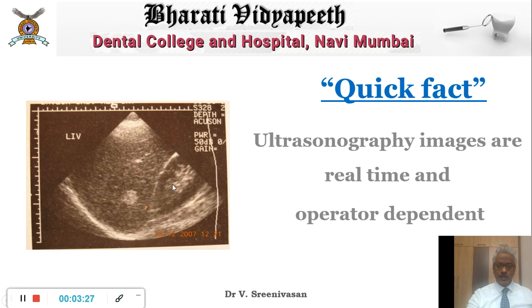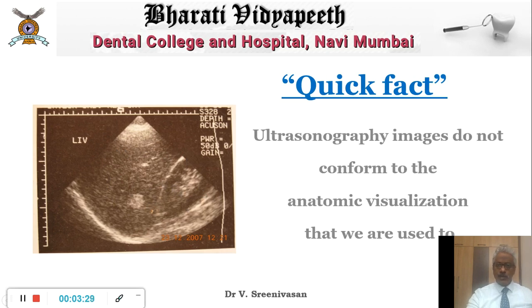So you need some special training because ultrasonic images do not conform to the anatomic visualization that we are used to. We see structures in a very macroscopic way, and here you're looking at layers of skin and connective tissue and bone. So it's a very different kind of layout that you're trying to see, and in that sense, ultrasonography is a very different imaging modality.